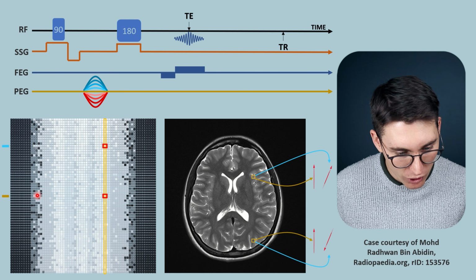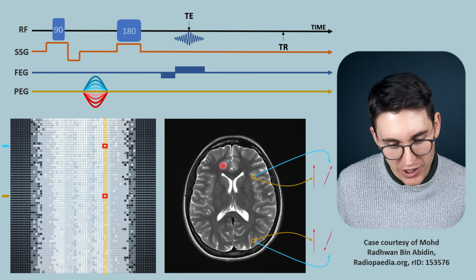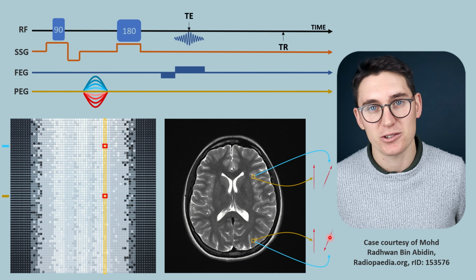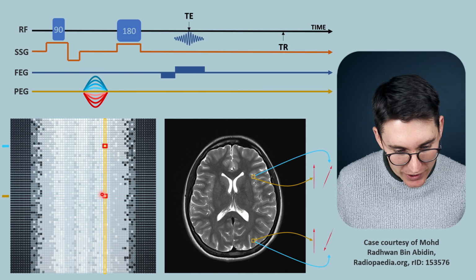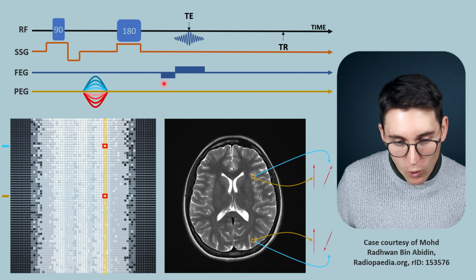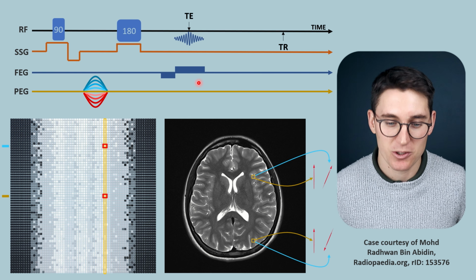One when we had no phase encoding gradient, and one when we've got a specific phase encoding gradient that means the spins in these two pixels are 180 degrees out of phase with one another. Now remember, the data that we are acquiring here at this given point represents all of the signal that is measured throughout the entire data acquisition period.